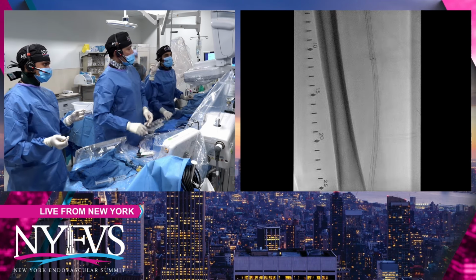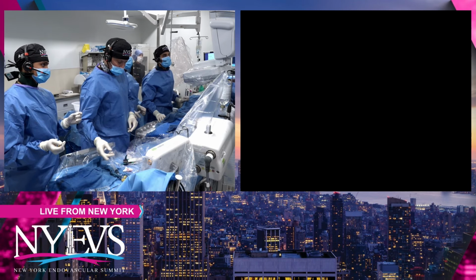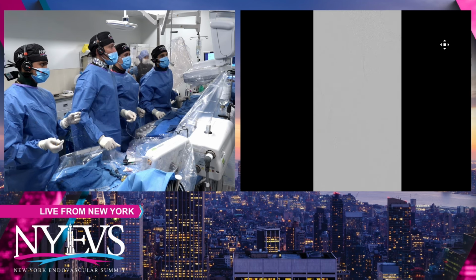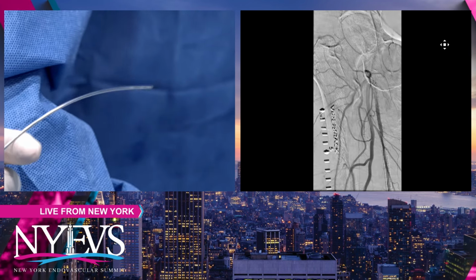I was just going to show you a quick picture after the Rotarex, to really show you how the 6 French Rotarex worked. And then you guys can go over by the time we do some other therapy. I fear that you will have no outflow.